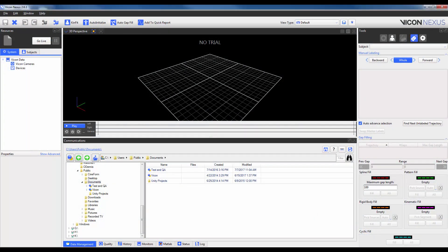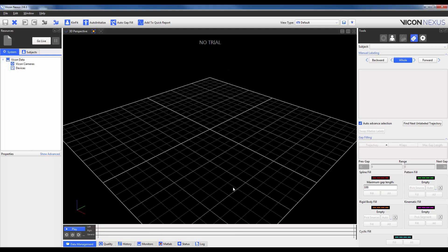When you first open Nexus 2, ProEclipse can be found in the Data Management tab within the Communications window. This window can be closed by either double clicking on the Data Management tab or by selecting the X in the top right corner. To reopen, I can double click back on the Data Management tab or I can select F2 on the keyboard.